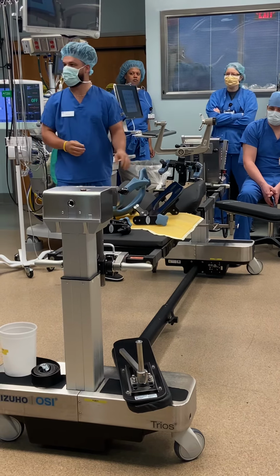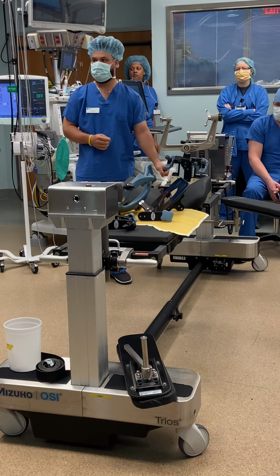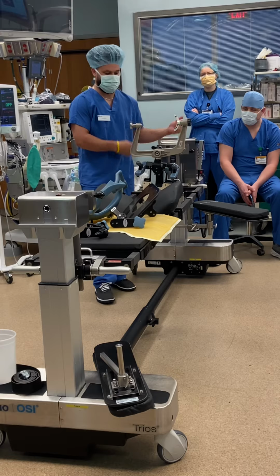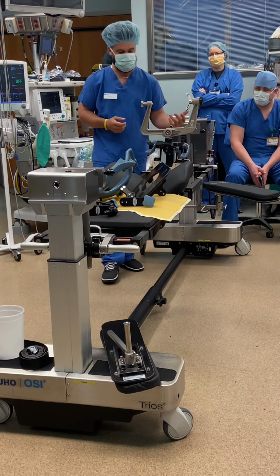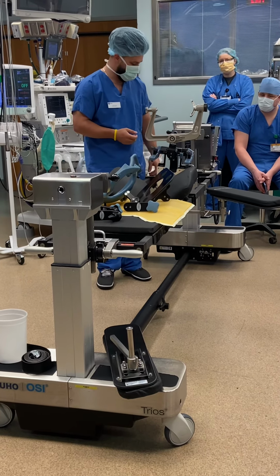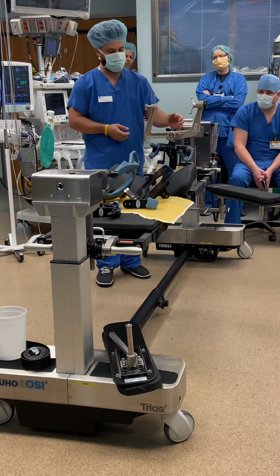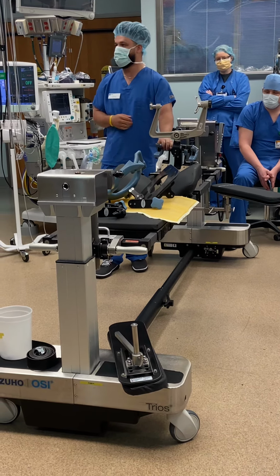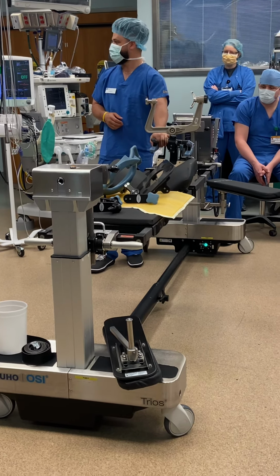Is there a drape that came with this? We don't have one. Okay, so for more sterility, there would be a drape that would go over it. I wanted to demonstrate that for you guys, but it's okay if you don't. Besides that, pretty self-explanatory. Is there anything you have questions about that I can touch on?